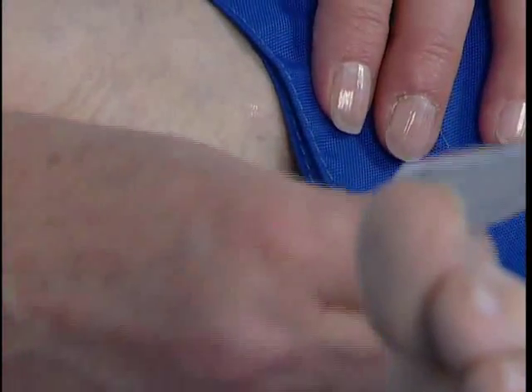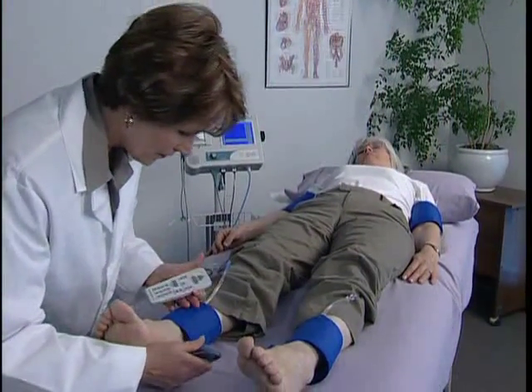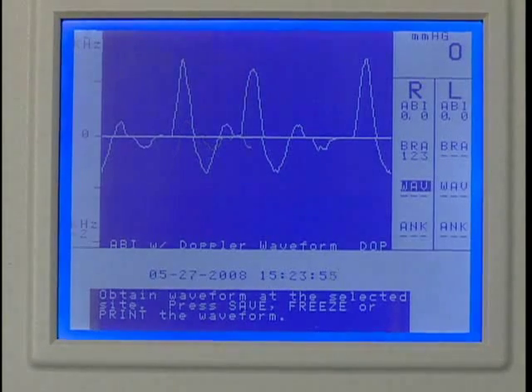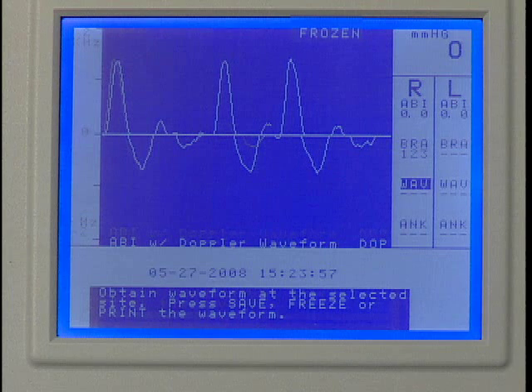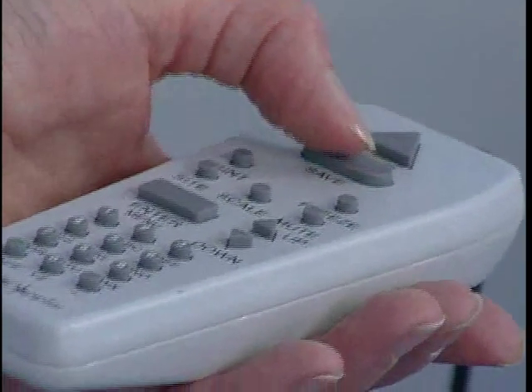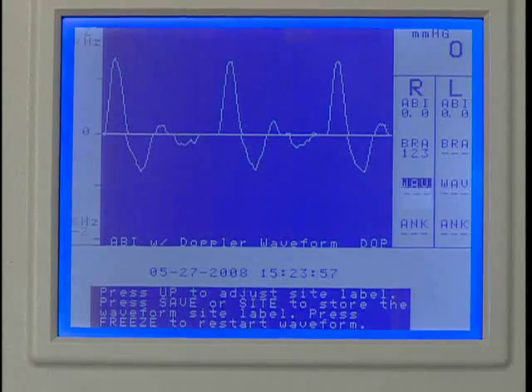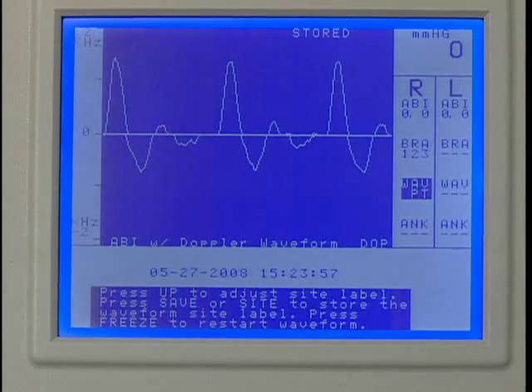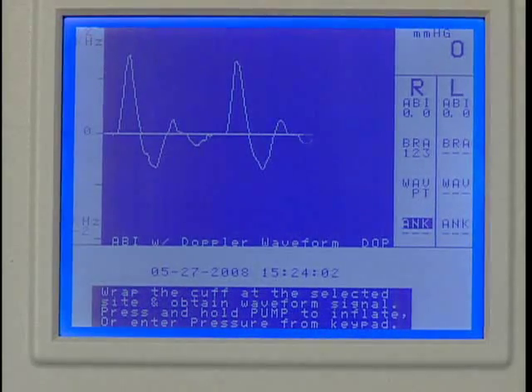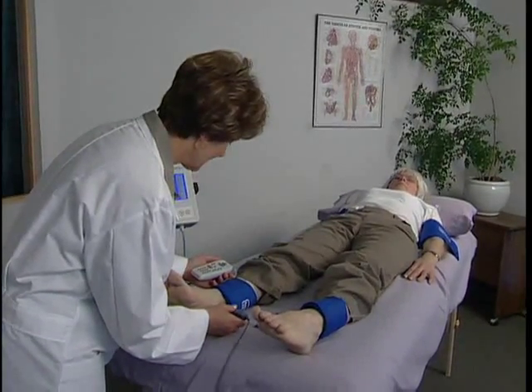Apply gel to the posterior tibial artery and use the Doppler probe to listen to the blood flow. Once the desired waveform is obtained, press Freeze. You have two options: if the waveform is acceptable, press Save to record it, or use the up or down key to scroll to the optimum waveform, then press Save to record it. Press Save again to move to the next protocol location.